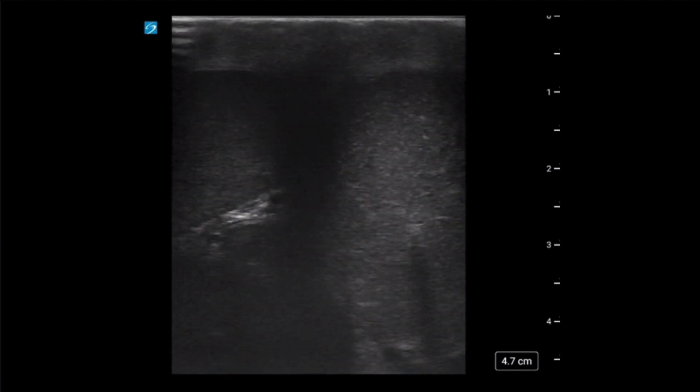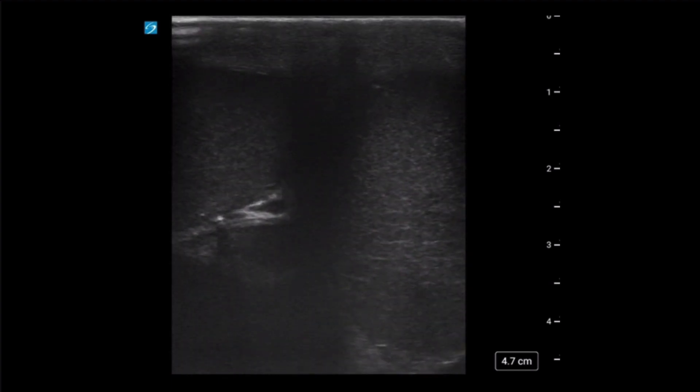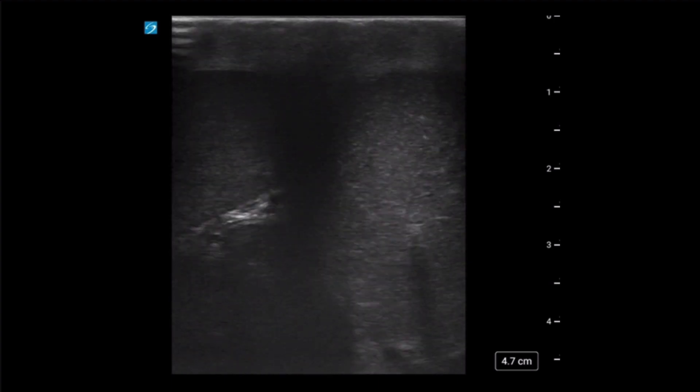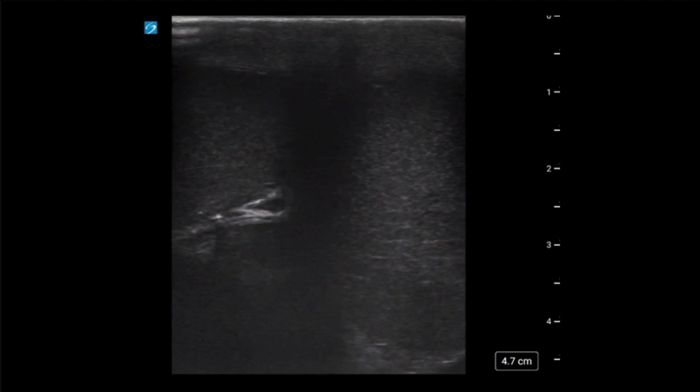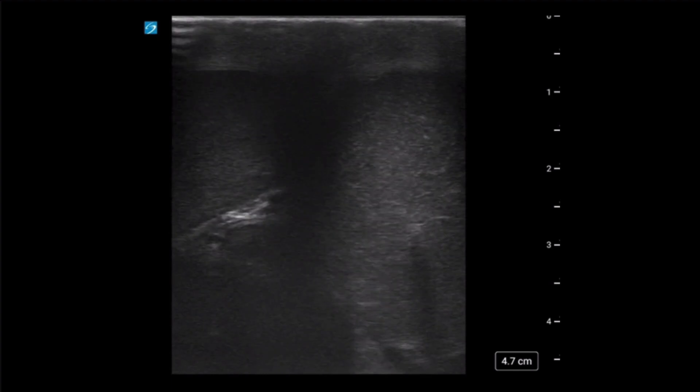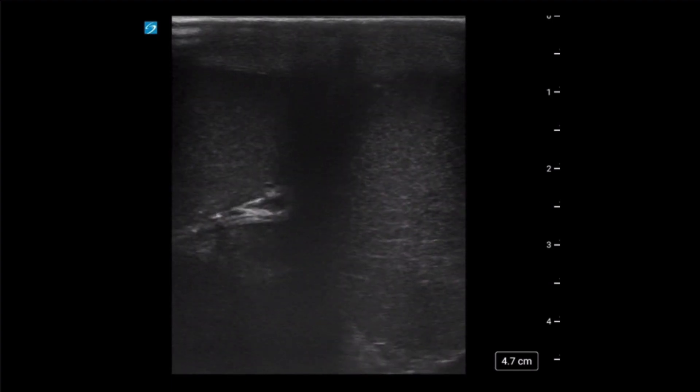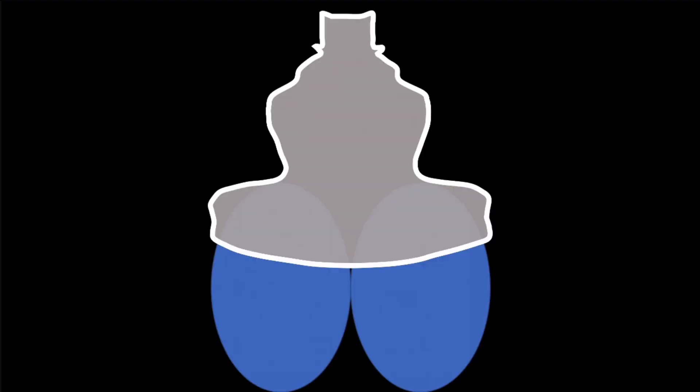In the first image, the linear transducer is utilized to image the bilateral testes in a short axis orientation with the probe placed transverse on the scrotum. A linear transducer is used given the higher resolution offered in this superficial structure. Elevation of the scrotum with a towel can help position the testicles to help with visualization.